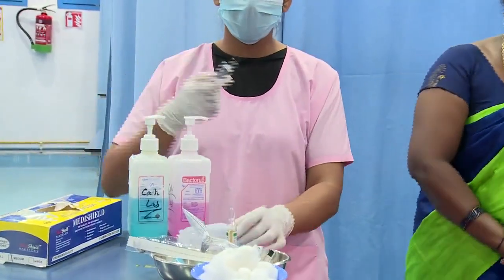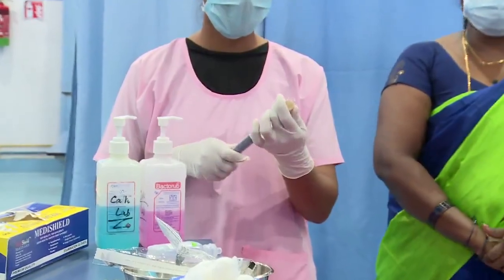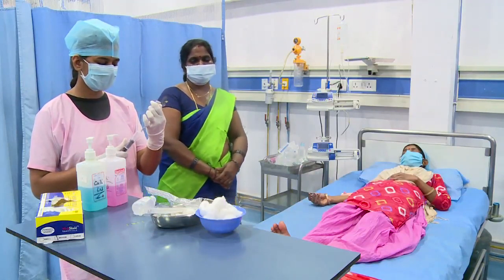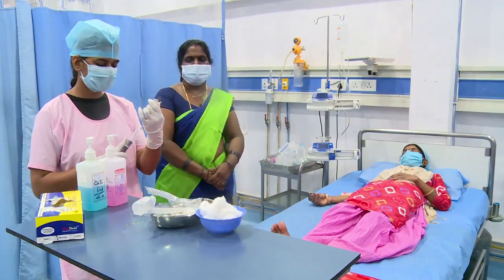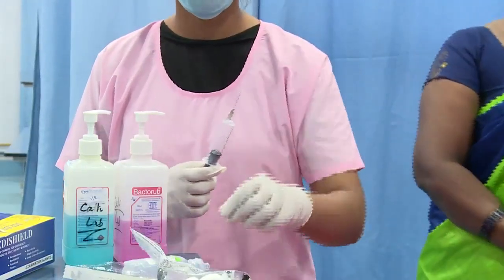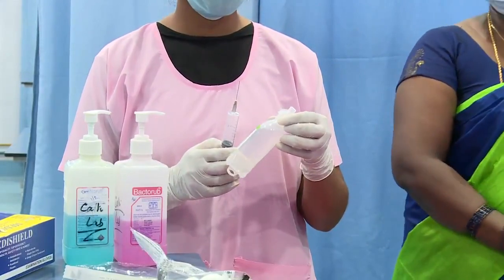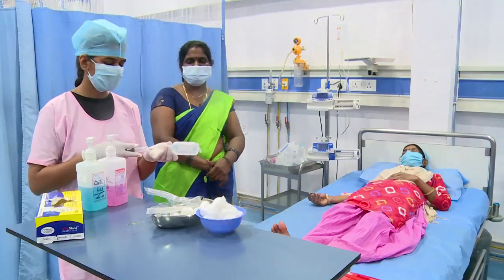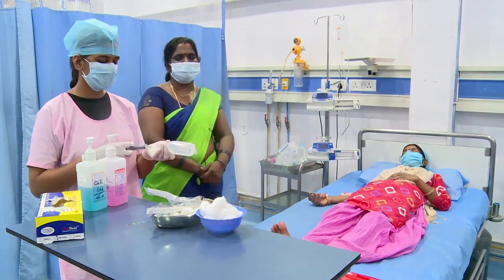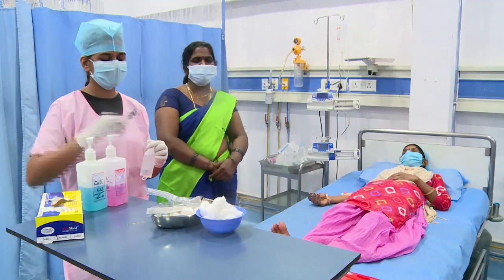Now she can take 10 ml of calcium gluconate and withdraw it from the ampoule. After that, the vial should go to the kidney tray. Now inject the 10 ml of calcium gluconate into the 90 ml of dextrose. Now the dilution of the solution is ready, and we are going to administer it to the patient.